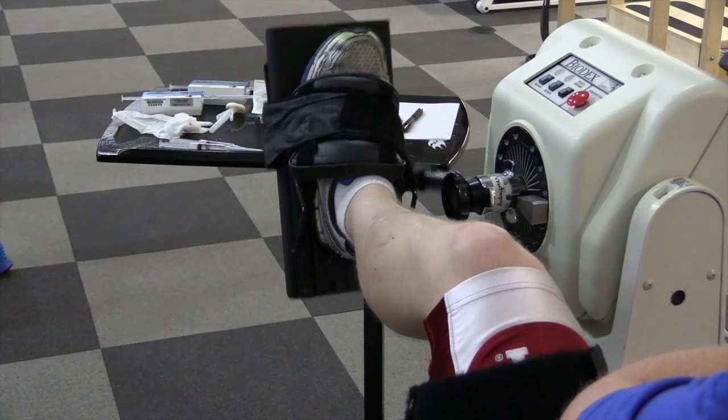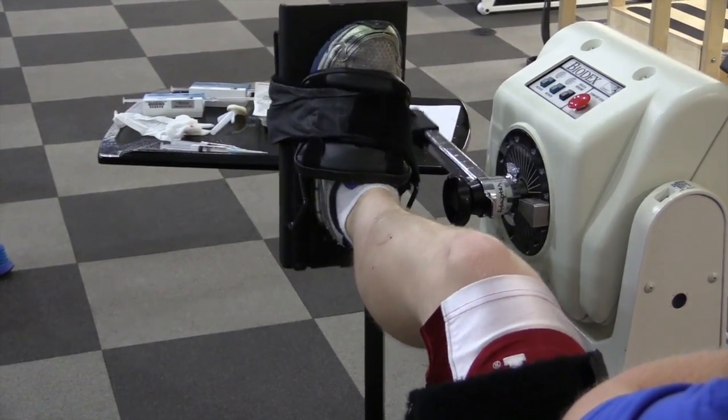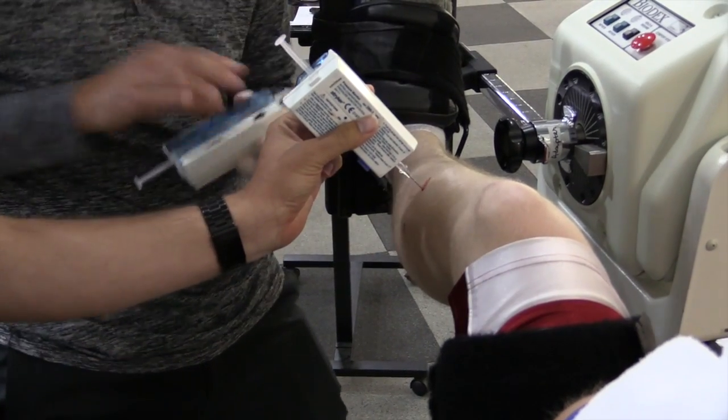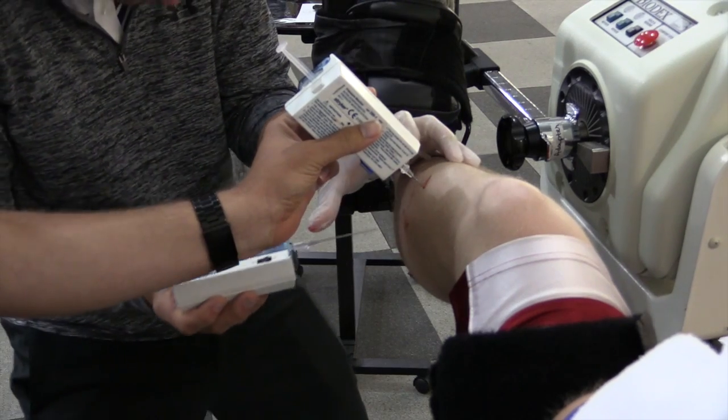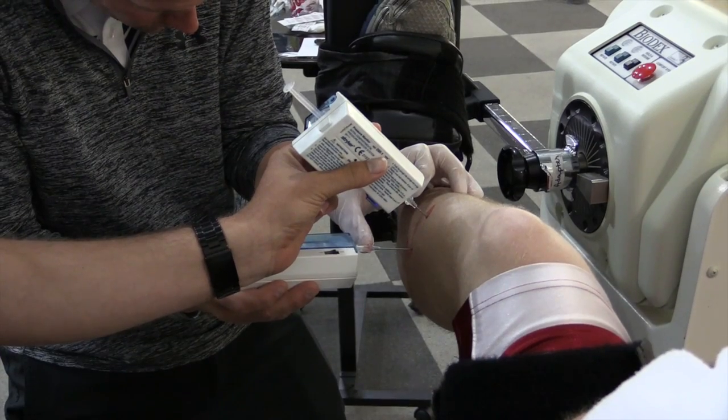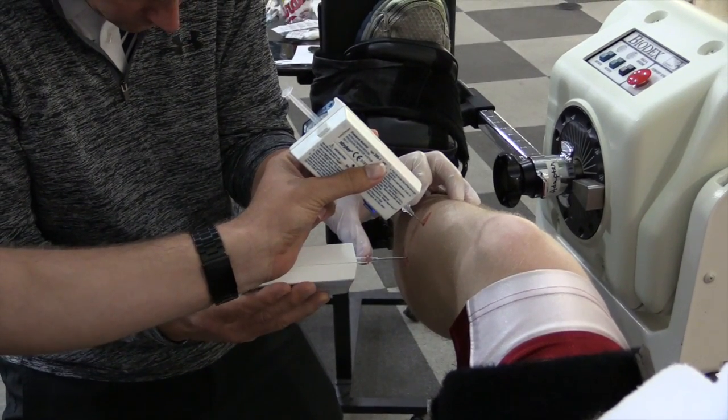After the patient has exercised for approximately five minutes and symptoms have been demonstrated, the pressure transducers are reintroduced into the anterior and lateral compartments and equilibrated for proper initial pressure readings.